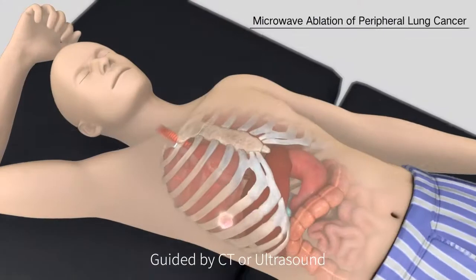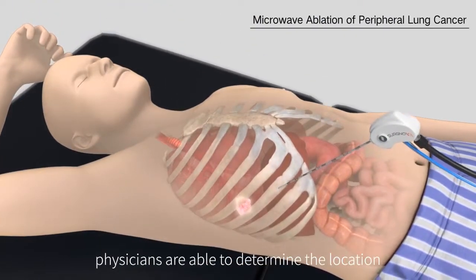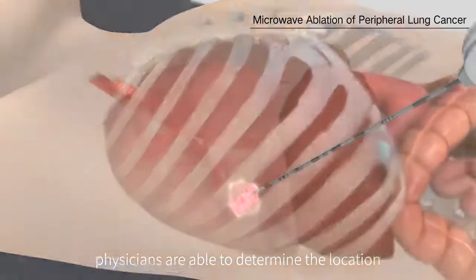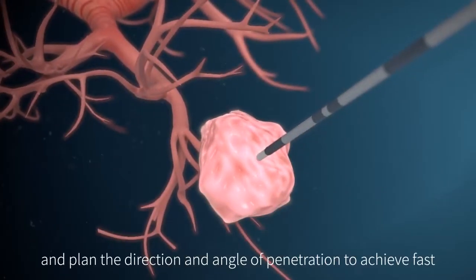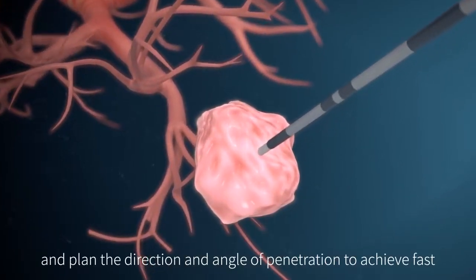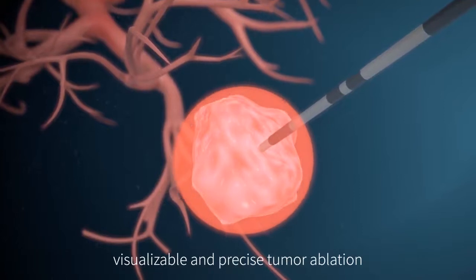Guided by CT or ultrasound, physicians are able to determine the location of the peripheral lung tumor and plan the direction and angle of penetration to achieve fast, visualizable, and precise tumor ablation.